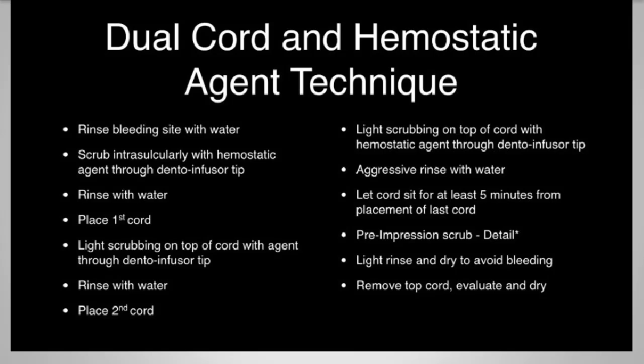We'll take a look at the sequence in impressioning, and this is exactly what we do at the university with our students, and many others around the country do this. I'm going to take you through the detailed steps and then show you pictorially thereafter. The very first thing we do is rinse our preparation and tissue with water. It's an aggressive water and air rinse. And we want to make sure there's no bleeding at that time. If there is bleeding, we'll go ahead and take care of it.